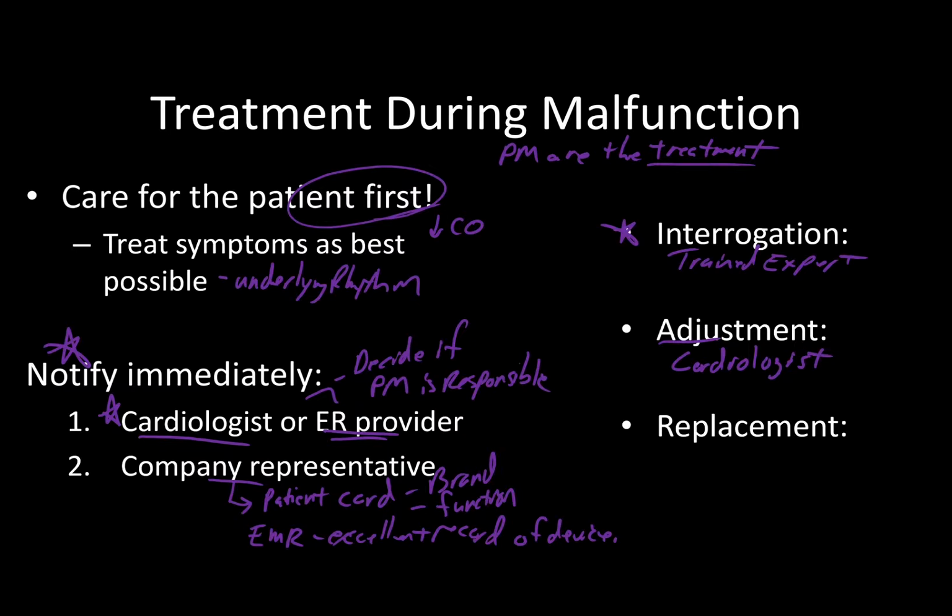They're the ones who are going to be able to read it and see what settings are best to help correct the problem. I've seen this done at the bedside a handful of times myself, that they'll have the device open, the patient's laying there, they'll hit a couple buttons, see what changes, make the adjustments, and then we'll write it out, see if that's effective or not, and maybe potentially change it again. It just really is a patient by patient scenario.